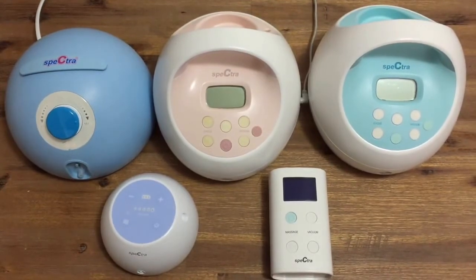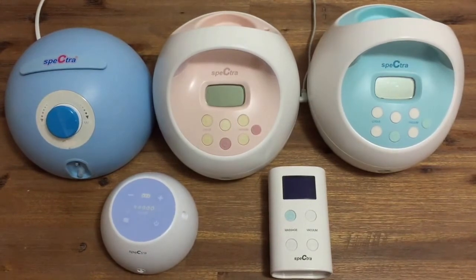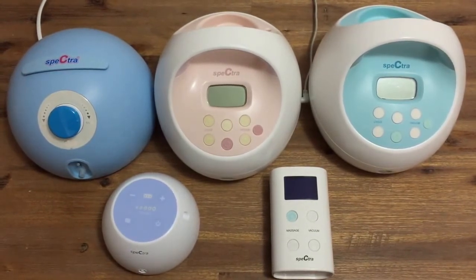If you have recently purchased one of our breast pumps and would like to see how to assemble them, please click on the link appearing on your screen now to access our introduction videos.